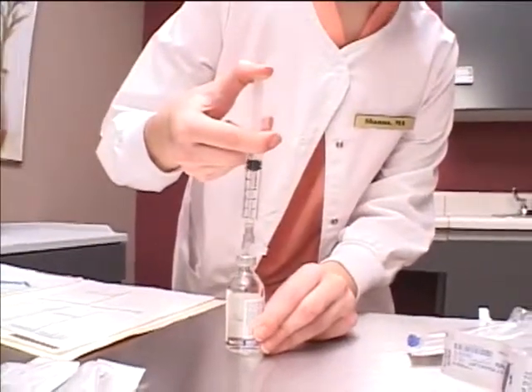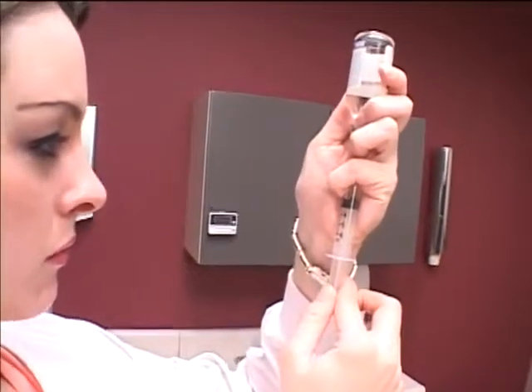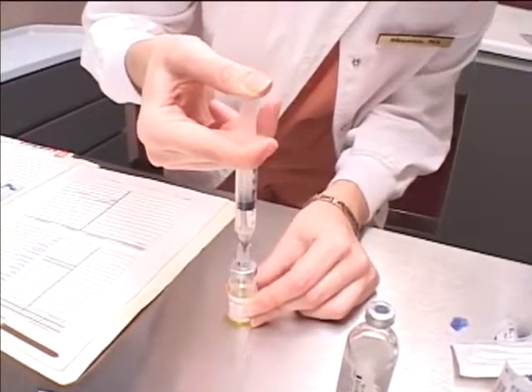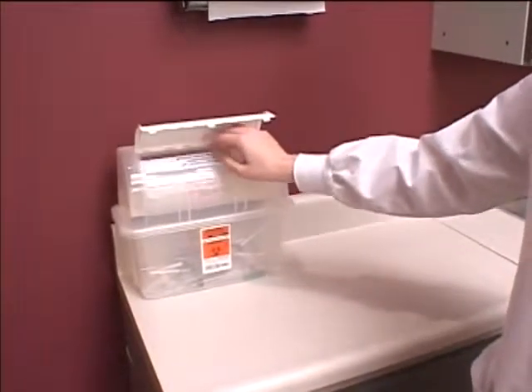Insert the needle into the vial and slowly inject the air. Invert the vial and hold it at eye level as you pull out the plunger and withdraw the appropriate amount of diluent. Transfer the diluent into the powdered medication vial. Remove the needle and syringe and discard into a sharps container.